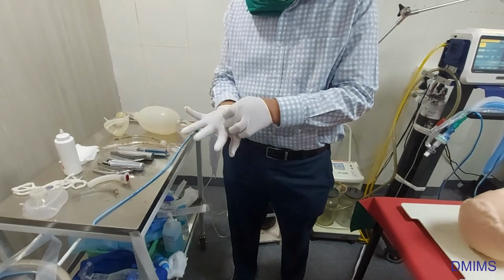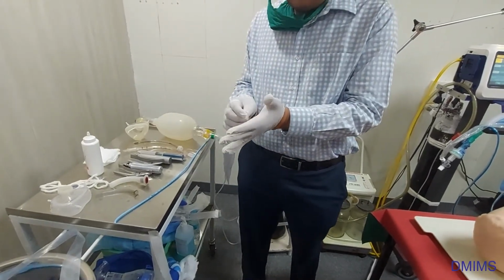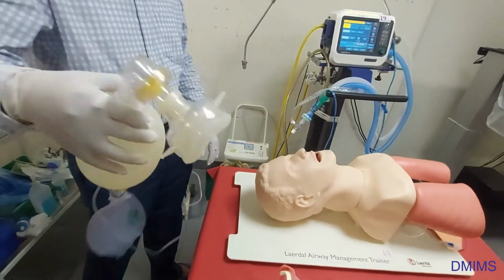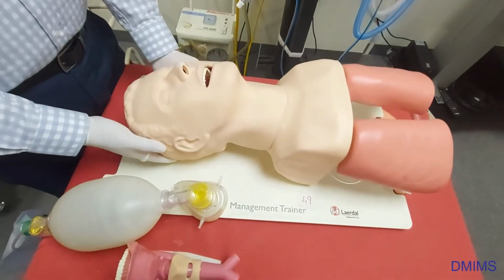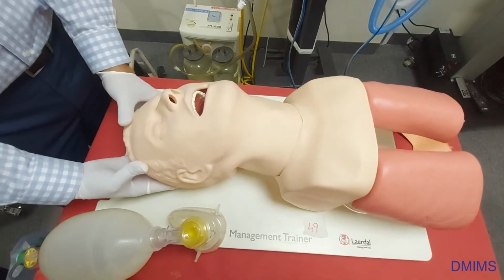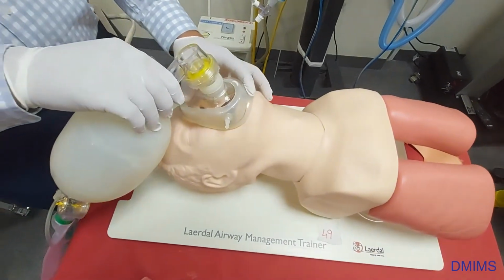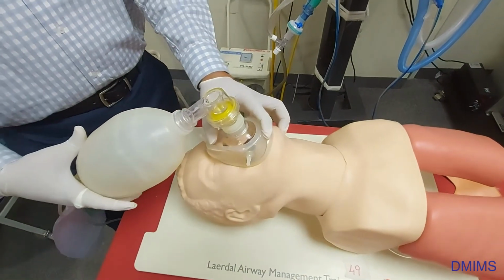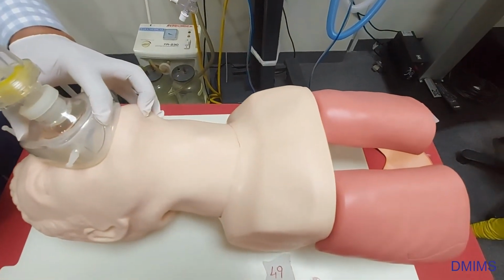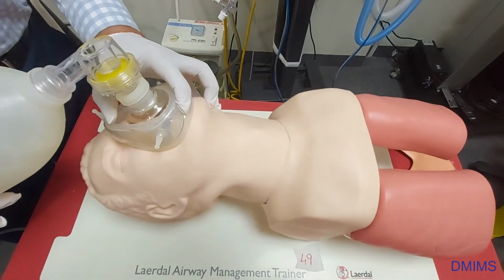Because we are talking about elective intubation, we need to give some sedation. When you give sedation and make the patient apneic or paralyzed, you have to manage the airway. Here on this mannequin we will see what to do. First of all, put the patient in the sniffing position. Extend the head so the mouth opens, apply the mask nicely, and make a proper seal. If the patient is apneic and unconscious, you can give rescue oxygenation. As you can see, I am able to ventilate. If I have not given any muscle relaxant, I will advise someone to give the muscle relaxant.